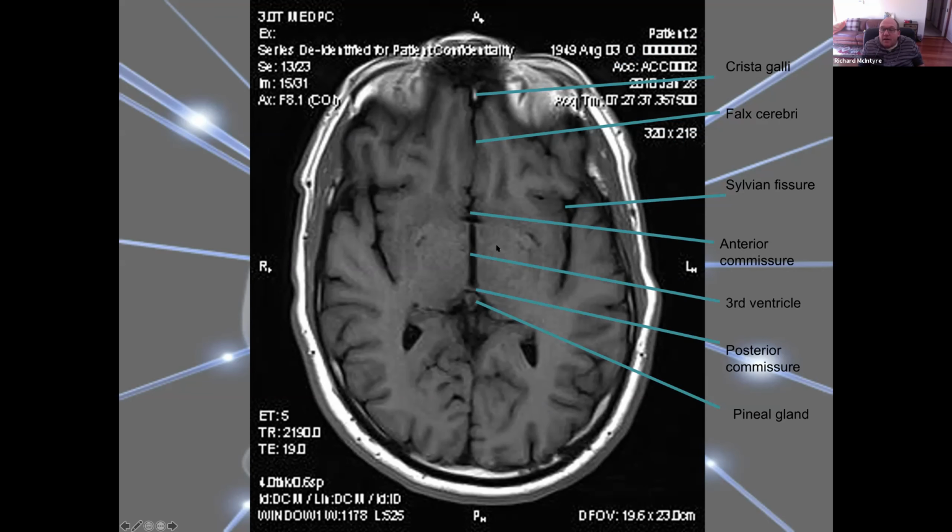One structure that we learn, certainly when you get into MRI and you do your scanning, you're going to know the anterior commissure and you're going to know the posterior commissure. They're crossovers, nervous tracts that send signals from one side of the brain to the other. And we align those up when we do our MRI. So you should always see those two structures on one image. That's our standard presentation for the MRI of the brain.